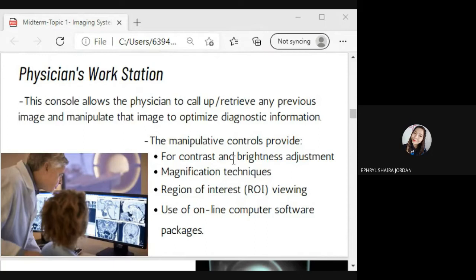And these software may include programs designed to generate plots of CT numbers, computation of mean and standard deviations of CT values in an ROI, subtraction techniques for angiogram, for example, planar and volumetric quantities, and also reconstruction of images like coronal view, sagittal view, and oblique planes.